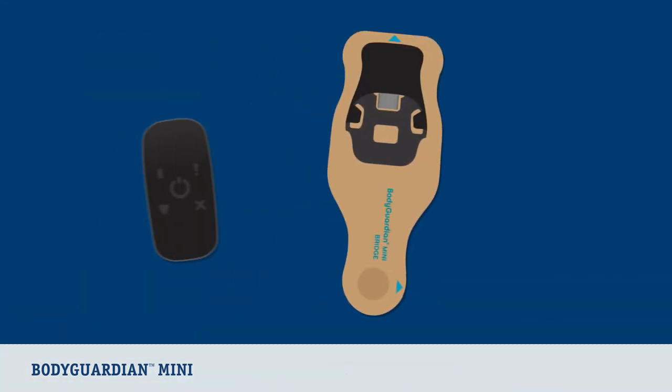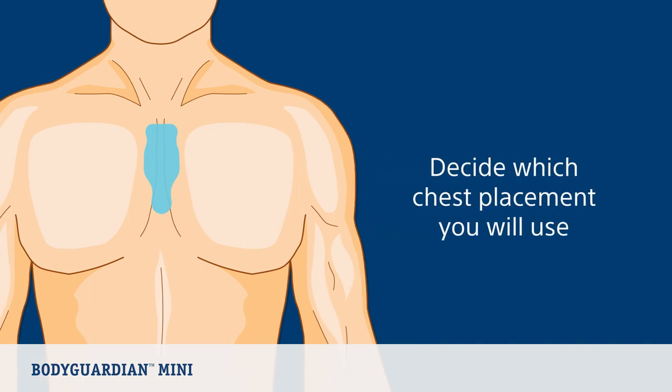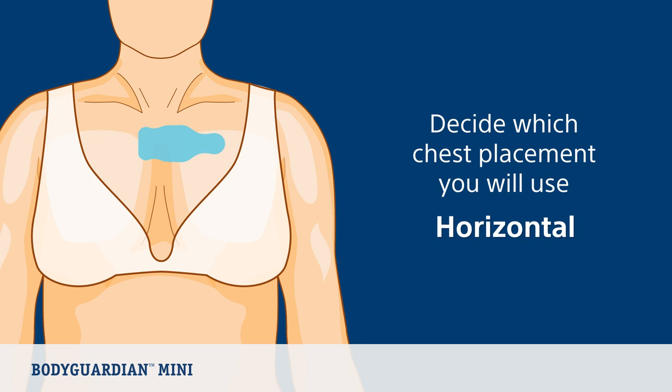Now let's go through placement options for wearing your BodyGuardian Mini with Bridge. First, decide which of the two chest placements you will use. You can wear the device either vertically on your sternum, which is the recommended placement, or horizontally on your upper chest.